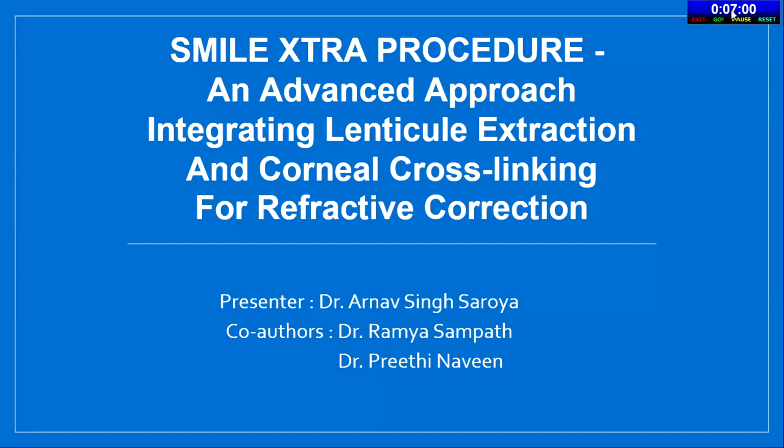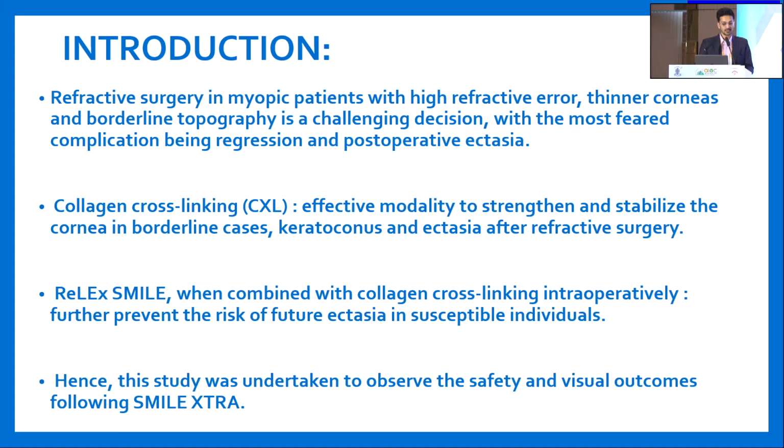My topic for the presentation is the SMILE Extra procedure, an advanced approach integrating lenticule extraction and corneal cross-linking for refractive correction. Refractive surgery in myopic patients with high refractive error, thinner corneas and borderline topography is a very challenging decision, with the most feared complication being regression and post-op ectasia.